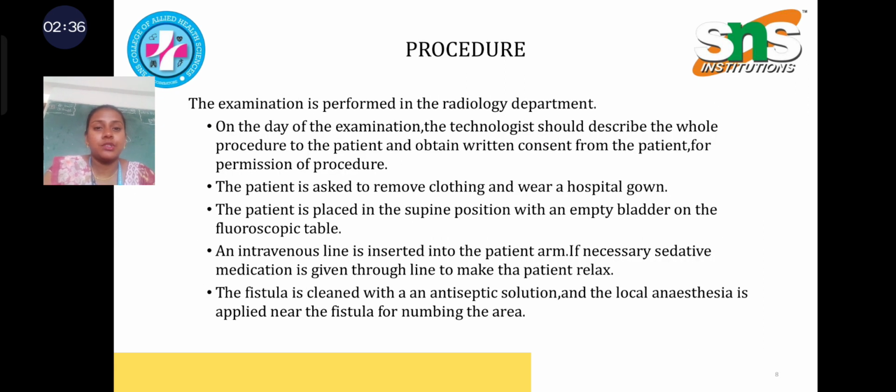How is the procedure performed? The examination is performed in the radiology department. A radiotechnologist will perform under the guidance of a radiologist. On the day of the examination, the technologist should describe the whole procedure to the patient and obtain written consent from the patient for permission of the procedure.